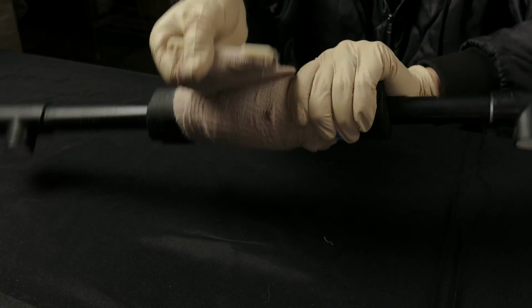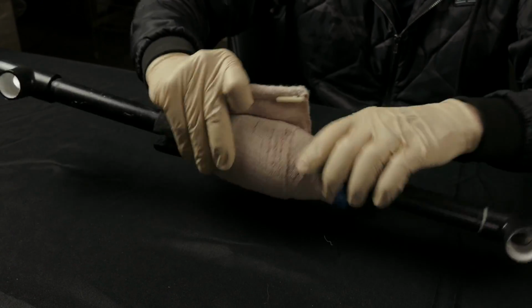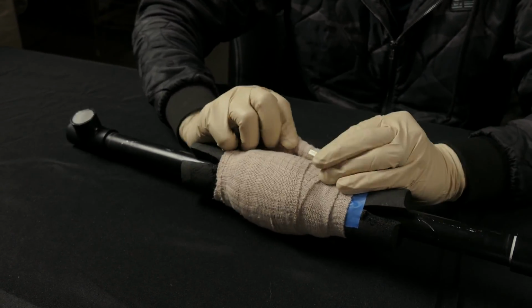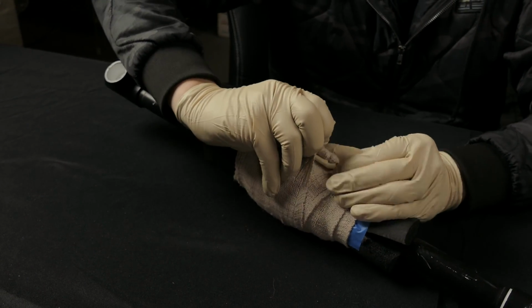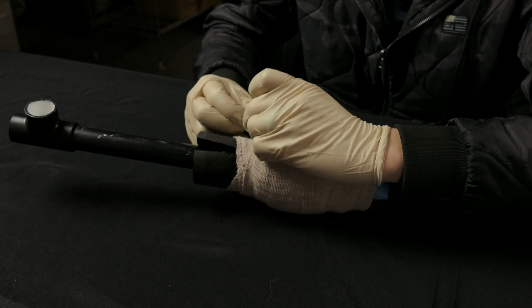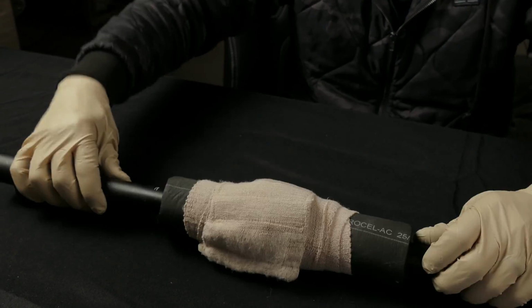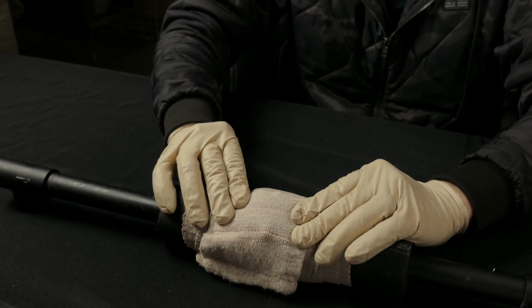Okay, so I get down to the end. I've got this little Velcro strip here on this ETD, Velcro that in place, and then I've got this plastic clip that I'm going to use just to secure it to make sure it doesn't come unraveled. So hook that on one side, hook this on the other, and there we go. Secured in place. I've got my pressure dressing. I've wound packed, pressure dressing on top of there. We've got pressure. It's still applying pressure even though I'm not having to touch it now.